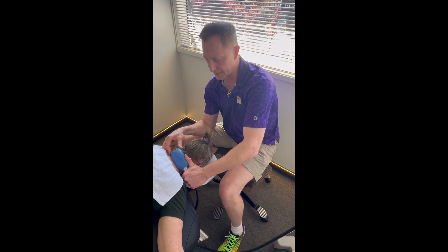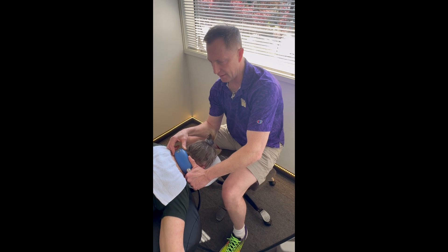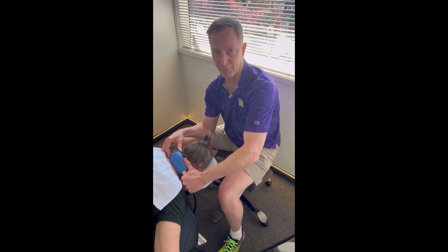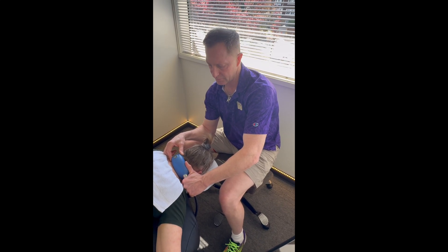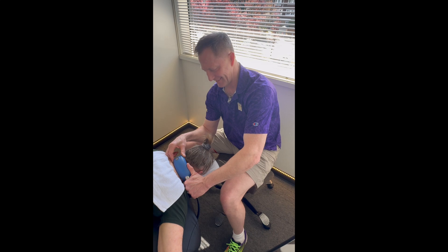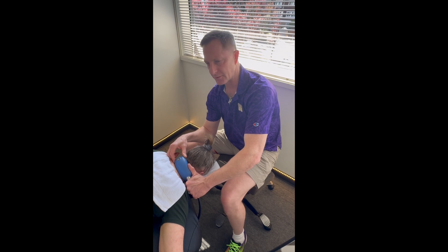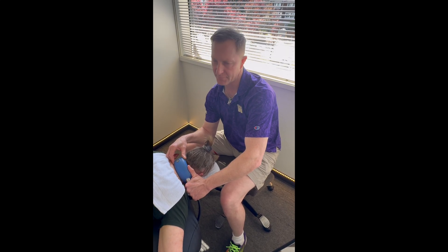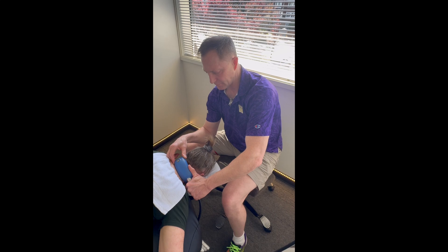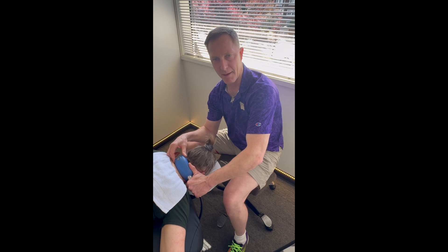If you look at a picture of the back of the spine, you'll see so many little nooks and crannies — ligaments, tendons, muscles, and even things that entrap nerves and constantly get irritated, causing lack of oxygen. Aching comes from lack of oxygen. You just can't give a massage deep enough for patients who have that chronic 'can you just really get in there?' feeling. This is what we use — and it's not damaging to the patient or to us. If you're interested, go to our website and schedule with Matt, myself, or Darshida.